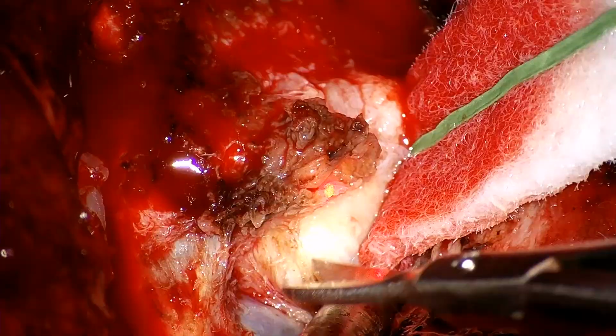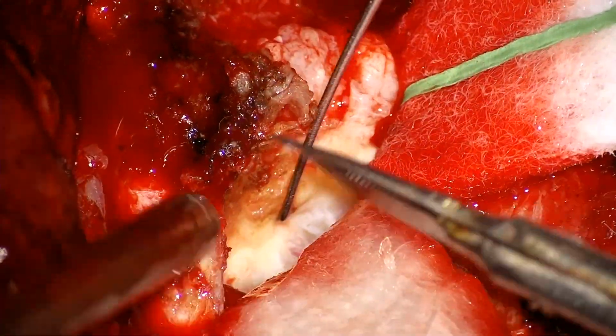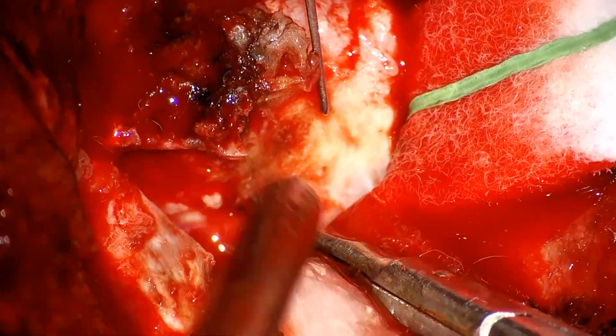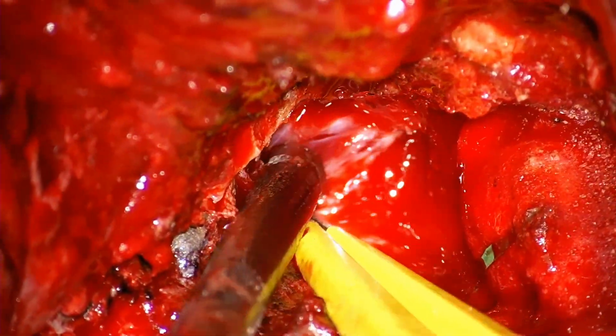Then we incise the dura of the convexity over the tumor margins to find the plane between the tumor and the arachnoid space. Using cottonoids, we create some counter-traction to expand the dissection plane while preserving the arachnoid for a smoother dissection.